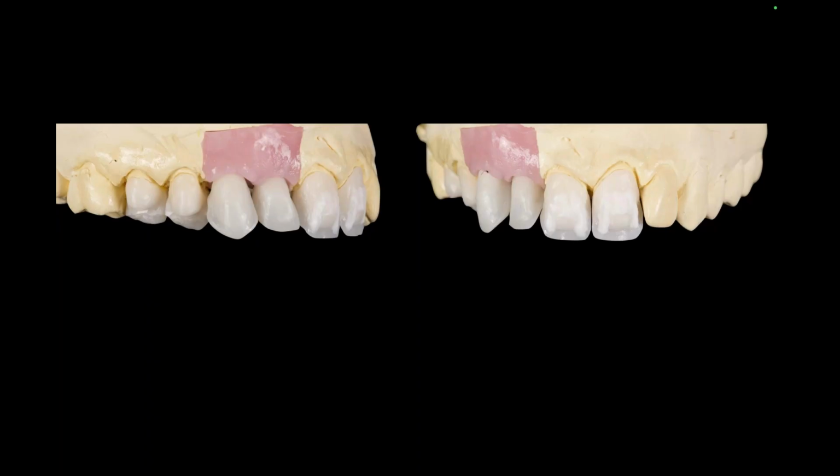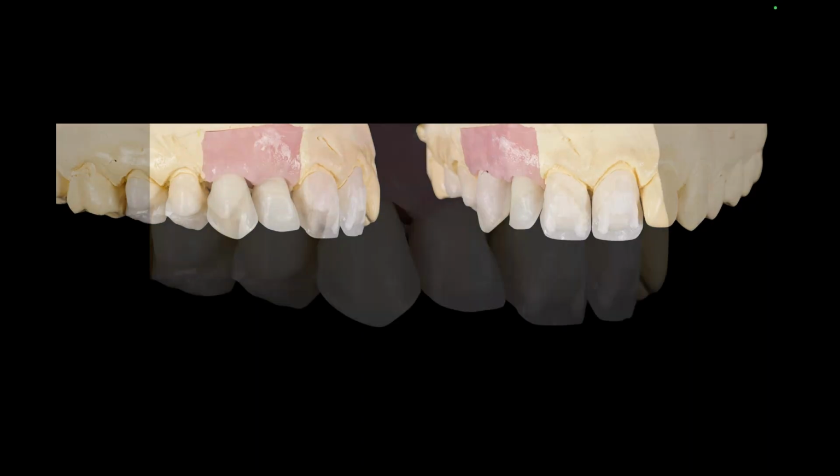We're also doing monolithic restorations, lithium disilicate and zirconia. Where I think our niche is, and where I hope your niche will be, is in the micro layering and the macro aesthetic of that. So in this case, I'm kind of going to do some of the layering, but look at my zirconia material. You can see I've already designed it where I have a thickness to that cervical at mid-third. I have my line angles kind of coming up, so I'm utilizing some of that zirconia material to help me.